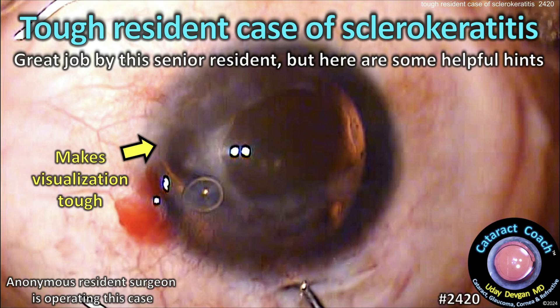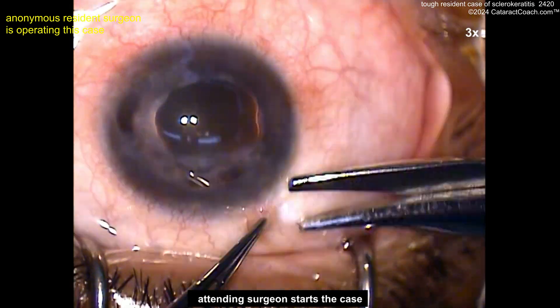Cataractcoach.com — a tough resident case of cataract surgery in sclerokeratitis. Great job by the senior resident, but there are some helpful things for you.